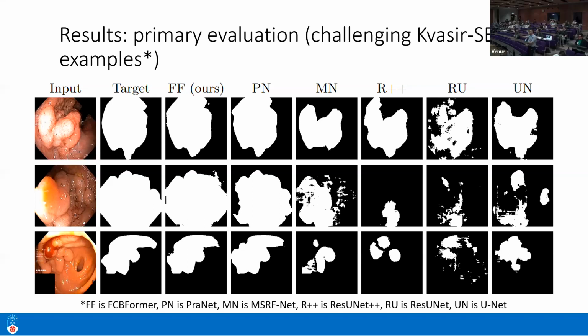Yeah, but it's surprising because when UNet doesn't perform well, it's because the training data was not sufficient or was not cropped. So if you see the top one, that is the best one, it's following down the shape of the polyp and is missing the last part on the top. But the middle one is really, really bad. Yes. So the question is more about the training data.